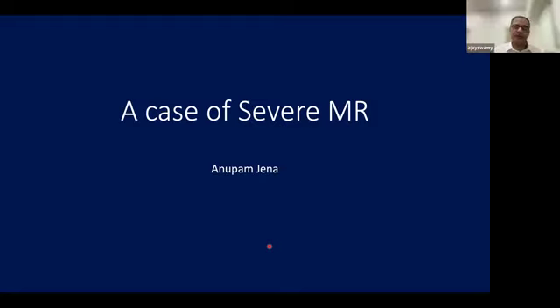I use angioseals routinely for closure of apical punctures. It works really, really well. Very easy. People use the ADO1 device also, but the angioseal is the best because most of your devices will easily go through a maximum of 7 French. You can easily close it. With an 8 French angioseal, we can easily. You can use a 6 French and a 7 French sheath also, even that will close.